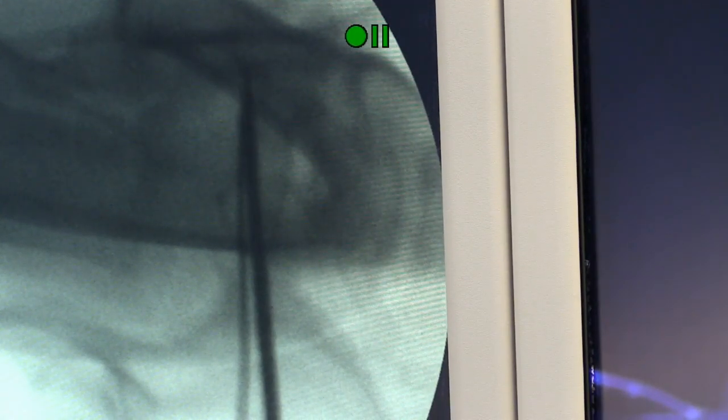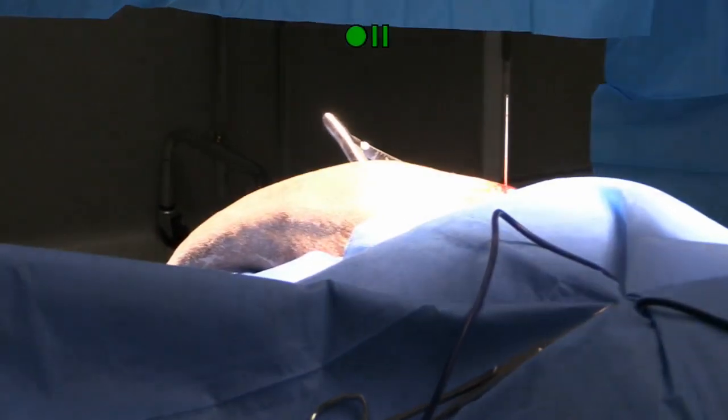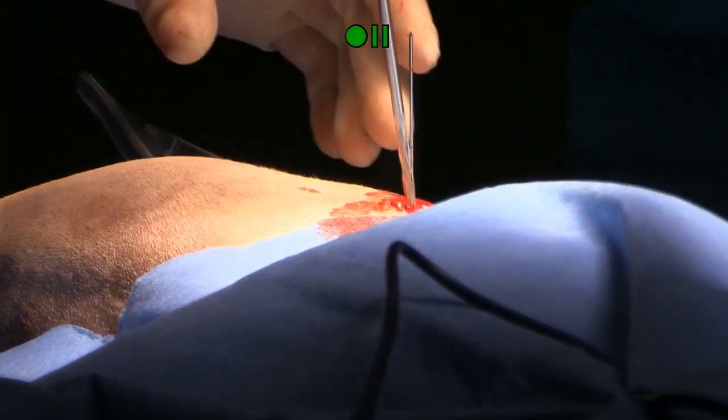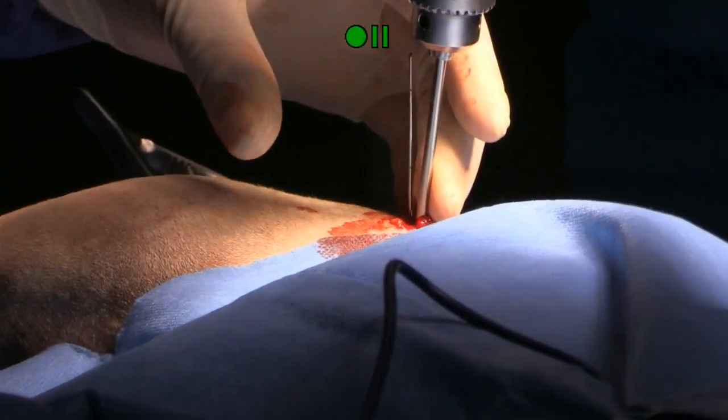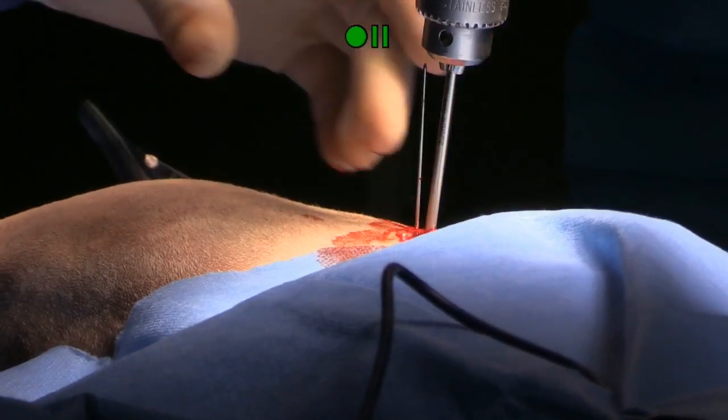And he's going to re-drill the near cortex, or the iliac wing, using a 3.5 millimeter drill bit, so that the threads in the 3.5 screw are going to glide through the bone and then engage in the sacrum.